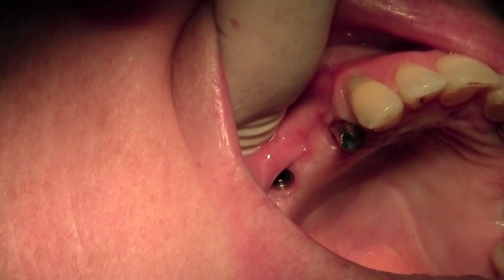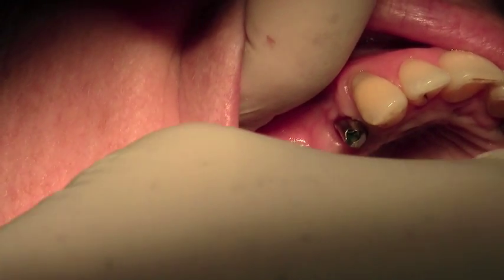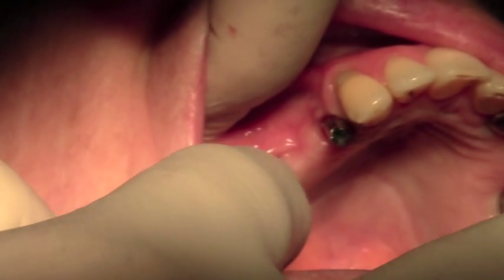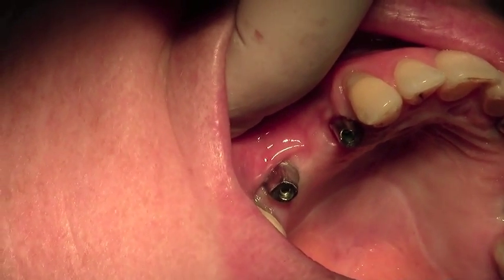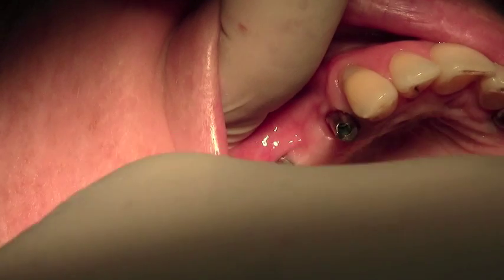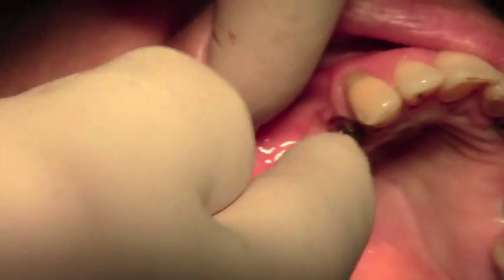Here's the next abutment — this is the molar 4.5mm. Again, this is a milled CAD-CAM Atlantis abutment. It seats beautifully positively down. Again, a very small buccal orientation dot to the buccal surface, and I'm going to use the 1.2mm driver to tighten this down. It only needs to be hand tightened, because what we're doing today is metal try-in. And there's the abutment tightened down.